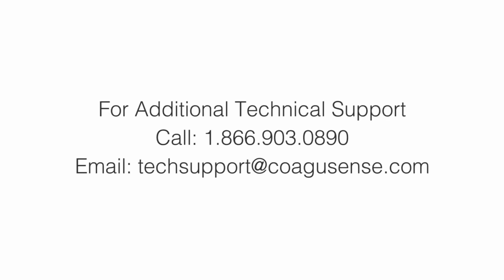If you encounter any error or require technical support, please call Coag-Sense Technical Support at 866-903-0890.